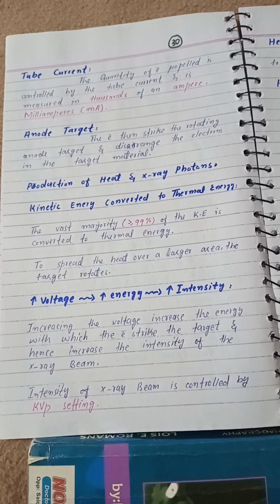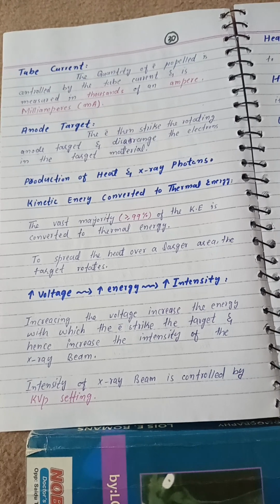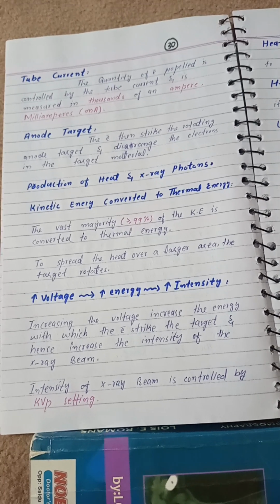Increase voltage, increase energy, increase intensity. Increasing the voltage increases the energy with which the electrons strike the target and hence increases the intensity of the X-ray beam. Intensity of the X-ray beam is controlled by the kVp setting.